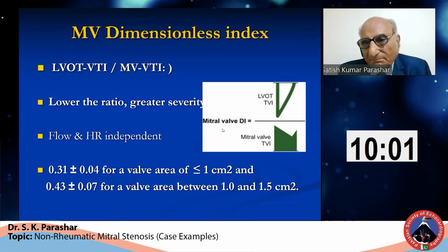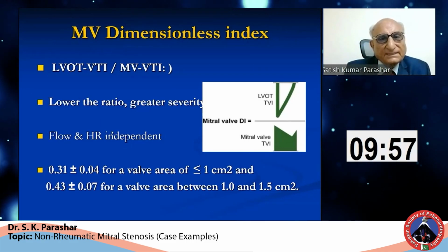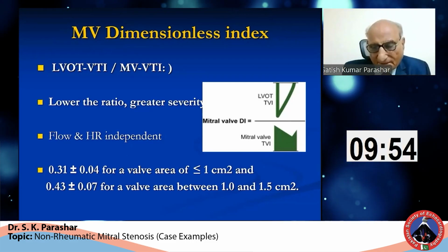So the best is to always take a dimensionless index and that can help in these cases.